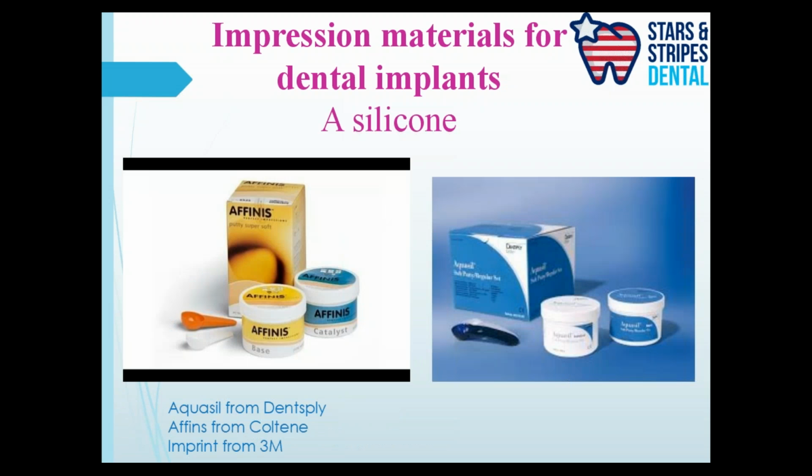Okay. So just to give you an idea, that doesn't mean that the impression materials are limited to these brands only. There are numerous brands available. But as long as you read the details of the brand of the material, you should be able to make out if this is polyether or polysulfide or silicones. Okay, so then you can make the judgment from there. Just a few names to put forward here.